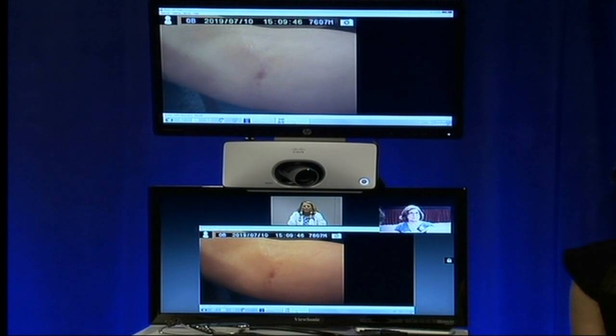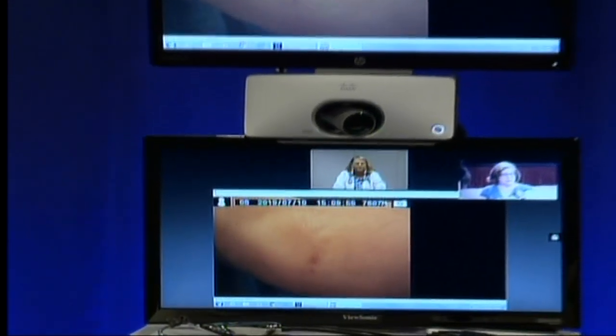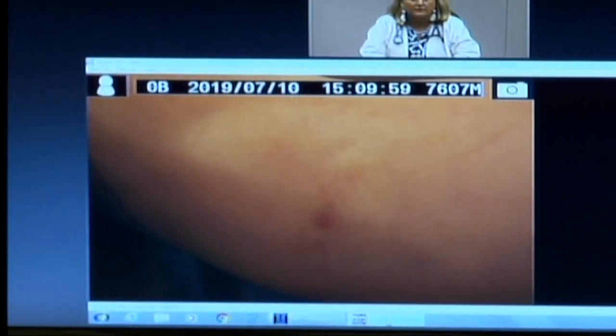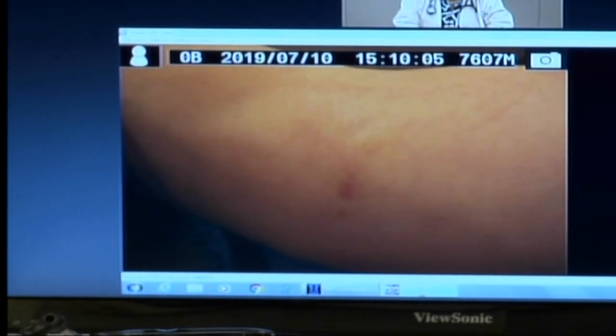Okay, I see it pretty well. Does it cause you any pain? Does it come about in any certain activities? No, I just get spots. They come up. They last for a few weeks. They go away. They're never raised. They don't cause any problem. I just don't know why I keep getting spots.